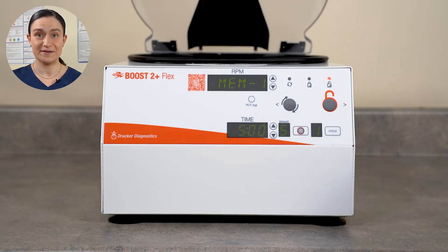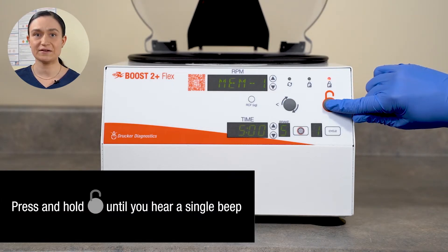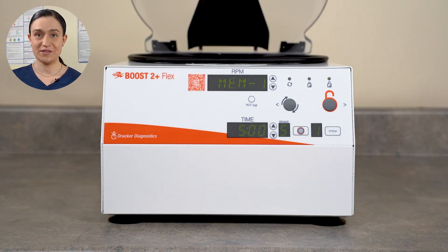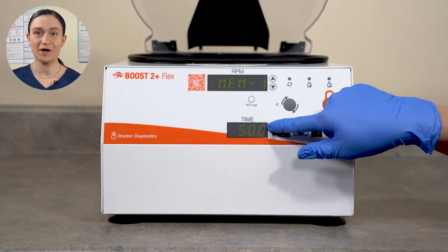Leave the lid open for the rest of this process. Press and hold Stop Unlock until you hear a single beep. Presets Only Mode is now engaged. You can select any preset you like, but cannot edit presets or make a new one.